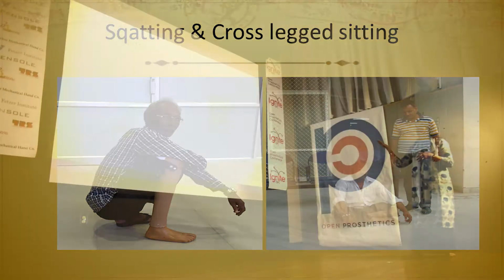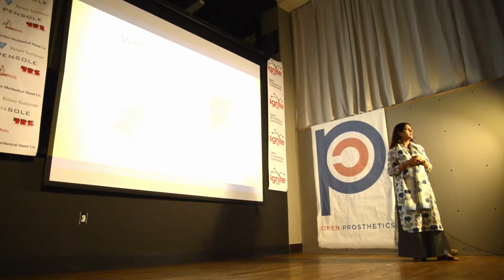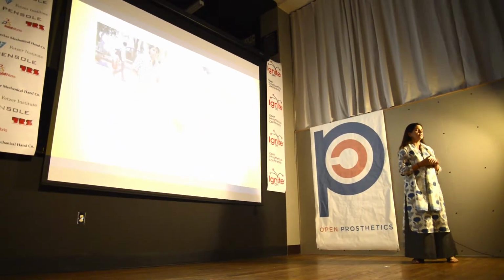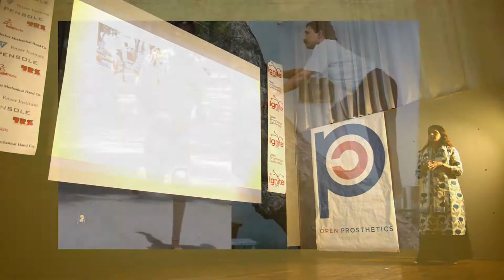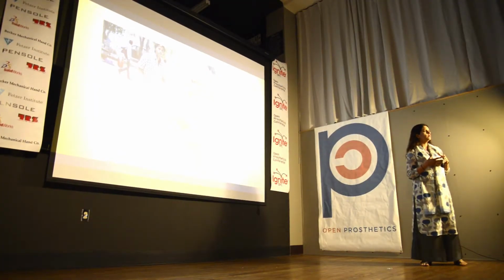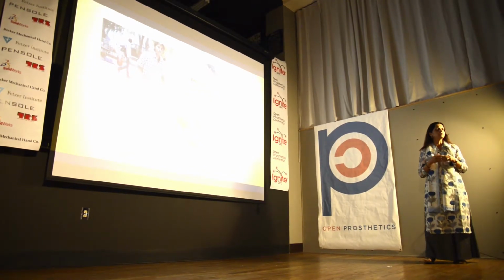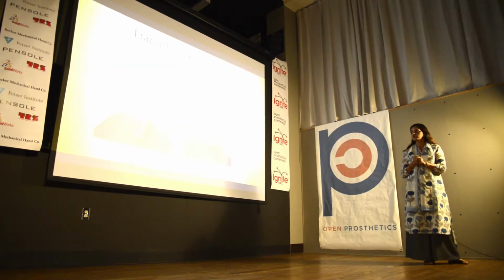It permits them to squat and sit cross-legged. Now, these are very essential postures in the Indian context or even in the Asian context. It permits people to run, climb trees, practically do anything they want. And it also permits people to walk without shoes, which is very important for us because to the church you can go with your shoes on, but to the mosques and temples you need to take your shoes off.